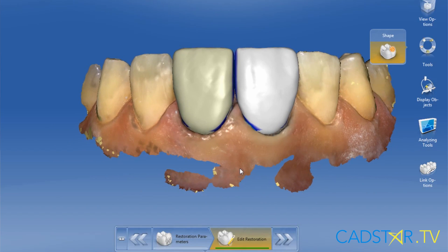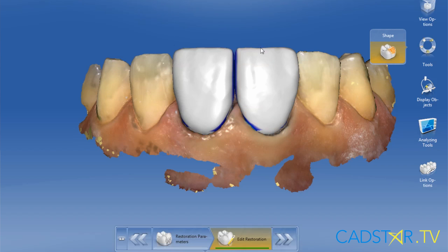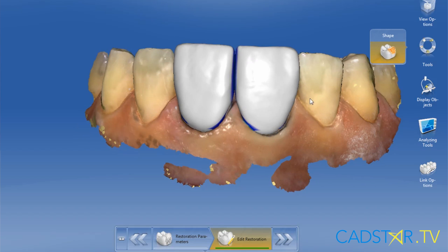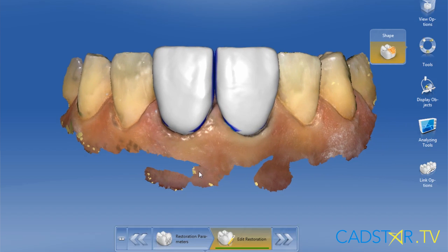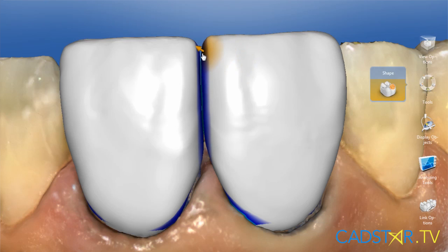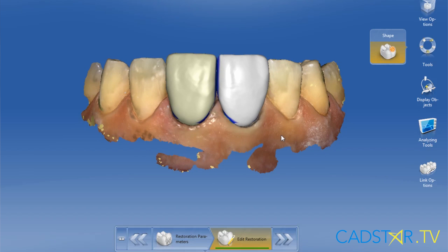Another nice feature of the 4.0 software when working on multiple anterior teeth is the link option. In this particular case, we prefer to slightly lengthen the two centrals. By simply activating the link option, I can use my tools and it will perform the same motion on the adjacent teeth, meaning that you can lengthen the teeth at the same time. Once you're satisfied with your virtual design, click the forward arrow to go to the milling phase screen, where you have the option for sprue location — that's how your virtual design is set up in your block — and you're ready to mill.